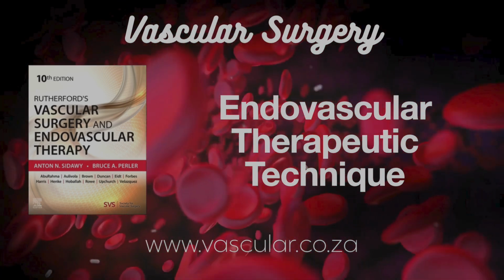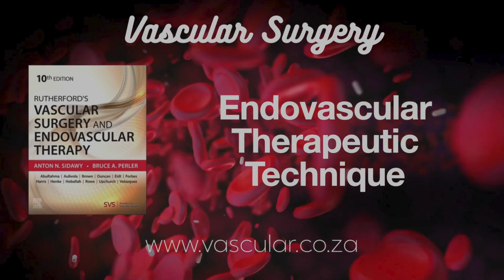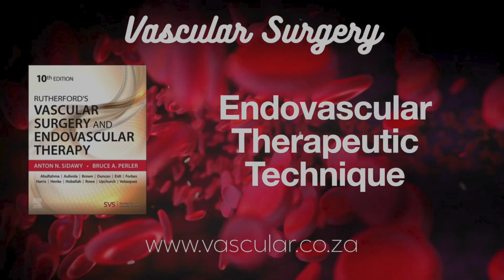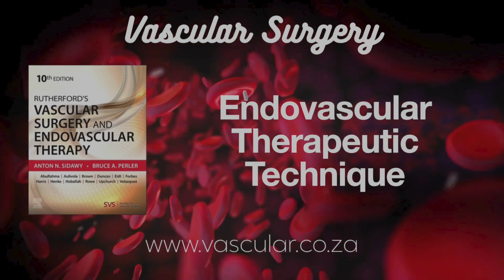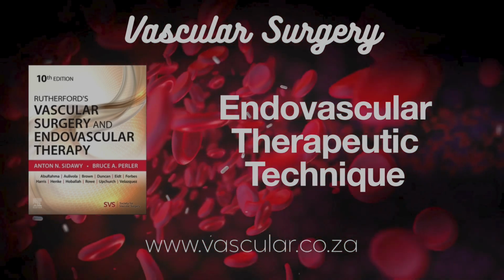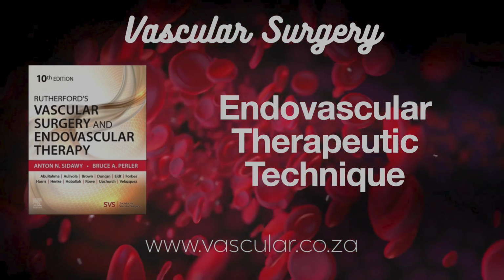Uses a small 4 French sheath, standard 0.014 wire. Like rotational, it creates very fine debris, thought to minimize embolization risk. Effective. The Confirm study showed it works well for calcified lower extremity lesions, significantly reducing plaque burden. Office-based studies also reported good patency rates at midterm follow-up.